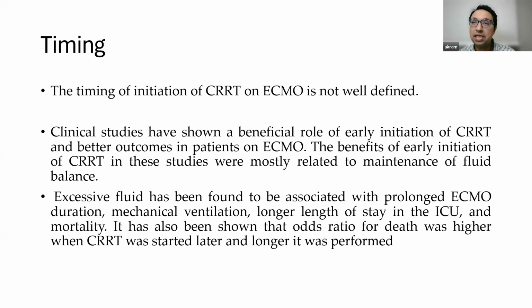The timing usually is the problem. The earlier, the better. So we don't wait, because these patients are very sick and very fragile. So usually we start as soon as there is acute kidney injury or oliguria, or even fluid overload in the absence of oliguria. Then we maintain the patient on CRRT and ECMO as long as he needs.